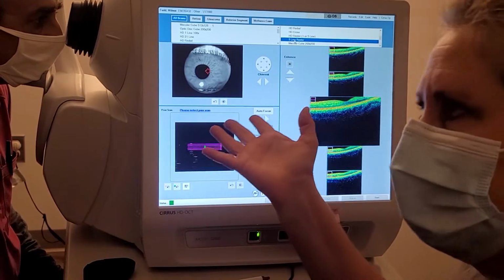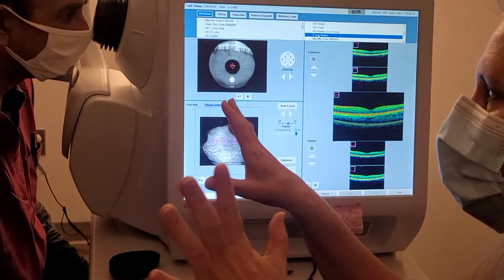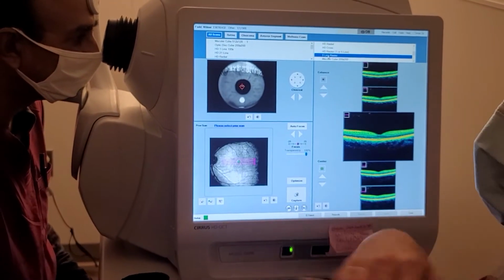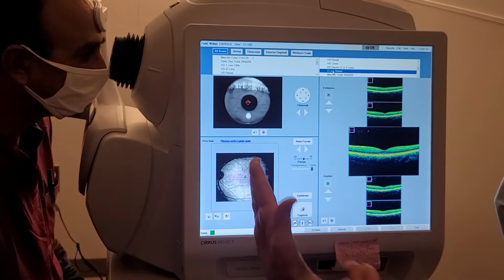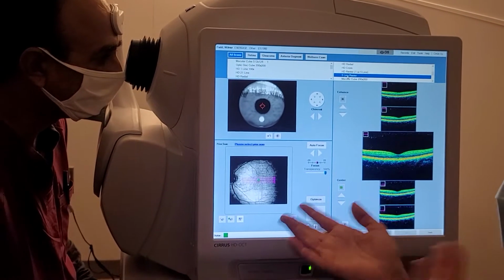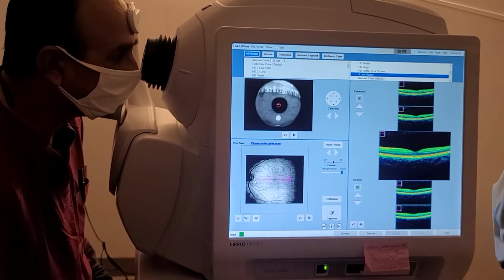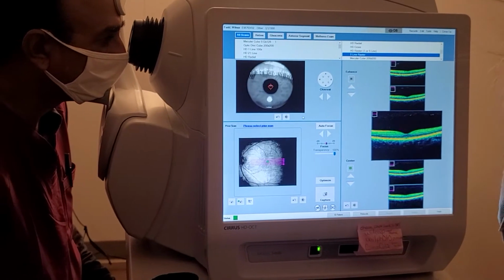With COVID, we don't really want to touch the patients that much, but otherwise you can. I always tell them, I'm going to turn your head a little bit, if you can't get them to go to the left or the right and they get confused because they're not really good with their left or their right. You're going to have all kinds of patients with different understandings.